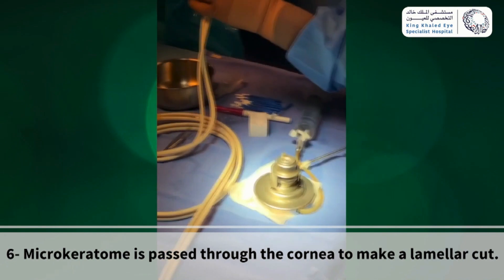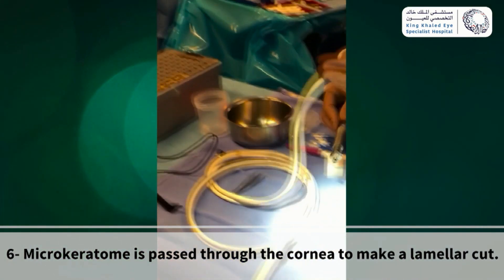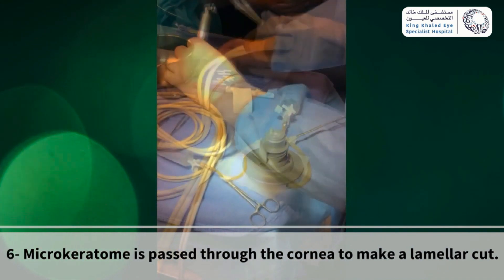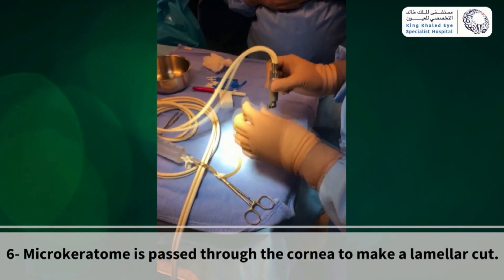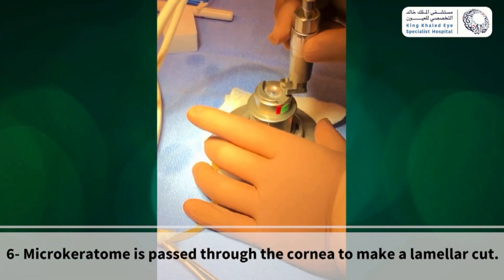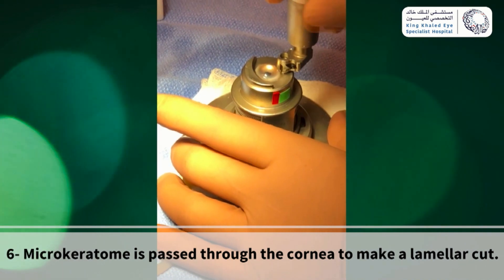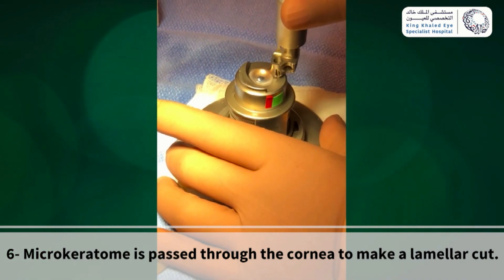Select the proper cutting blade and test it by oscillation in BSS by stepping on the vacuum pedal. Next, with your dominant hand, mount the keratome onto the piston base at the post and position at 5 o'clock.